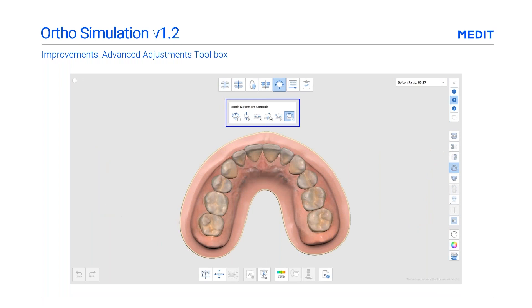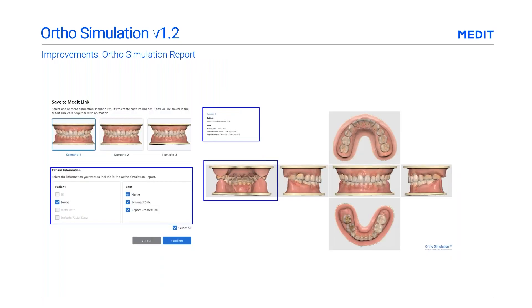You can move the control box to anywhere on the screen. Medit has also added patient information and lingual view to the Ortho Simulation report.